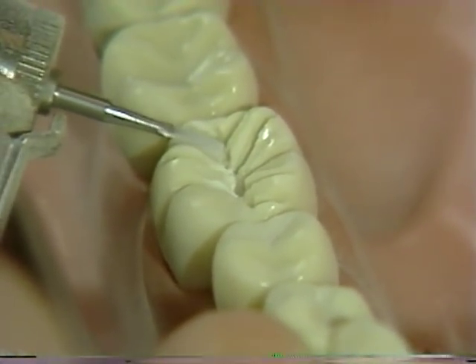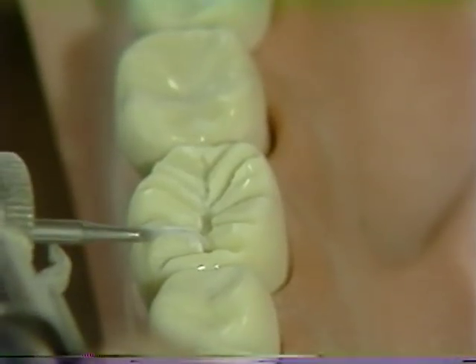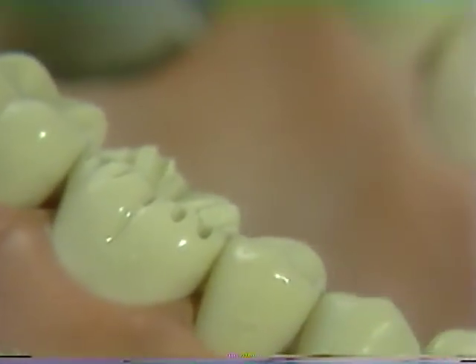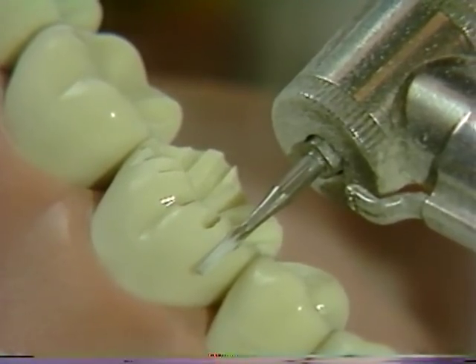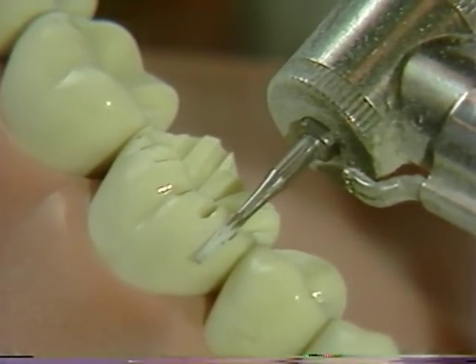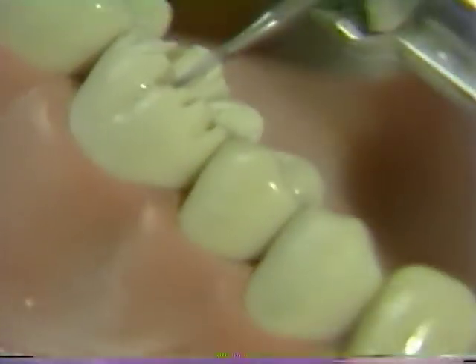When working in close proximity to adjacent teeth, you should exercise some caution so as not to damage them. The occlusal aspect of the depth cuts has been completed. Now the buccal depth cuts will be extended over the crest of the buccal cusp and will serve to place the so-called functional cusp bevel. These depth cuts will be approximately 1.5 millimeters near the crest of the cuspal ridge but will fade into the existing buccal surface.